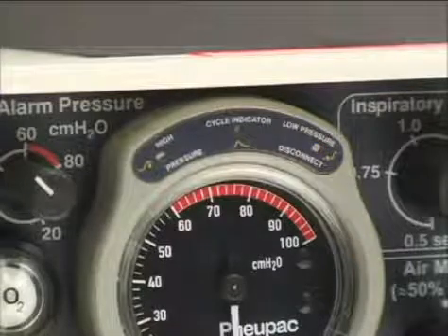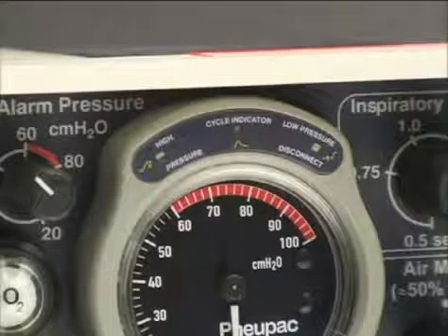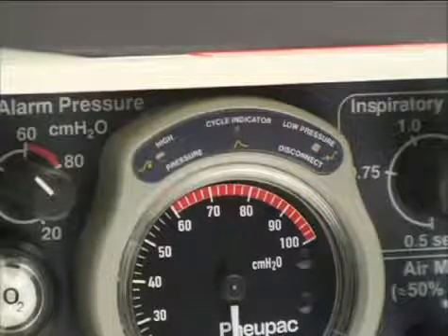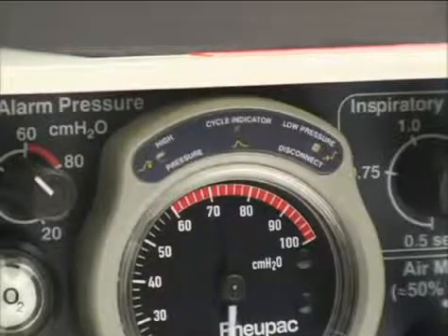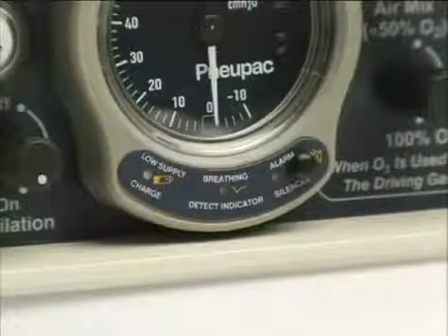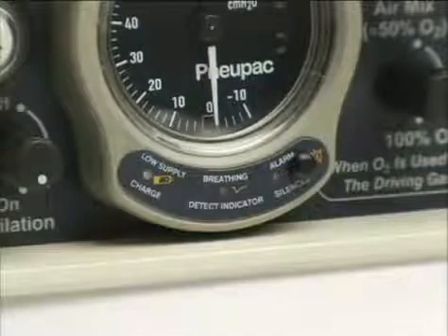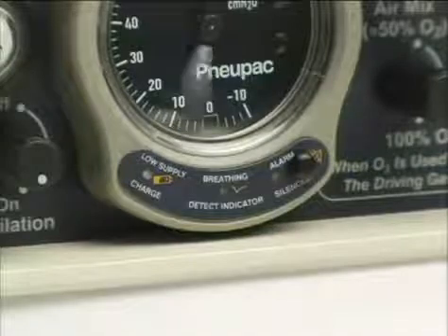This audible and visual alarm can mean a disconnection in the ventilator breathing system. When inflation pressure does not rise through the preset level of 10 centimeters of water pressure at least once in any 10-second period, this alarm will flash yellow, warning that the ventilator is not cycling correctly. An orange light flashes every 3 seconds to indicate that an electronically generated audible alarm has been silenced. For 60 seconds after you turn on the ventilator, the system automatically suspends all alarms except the supply gas failure indicator and high priority visual alarm.